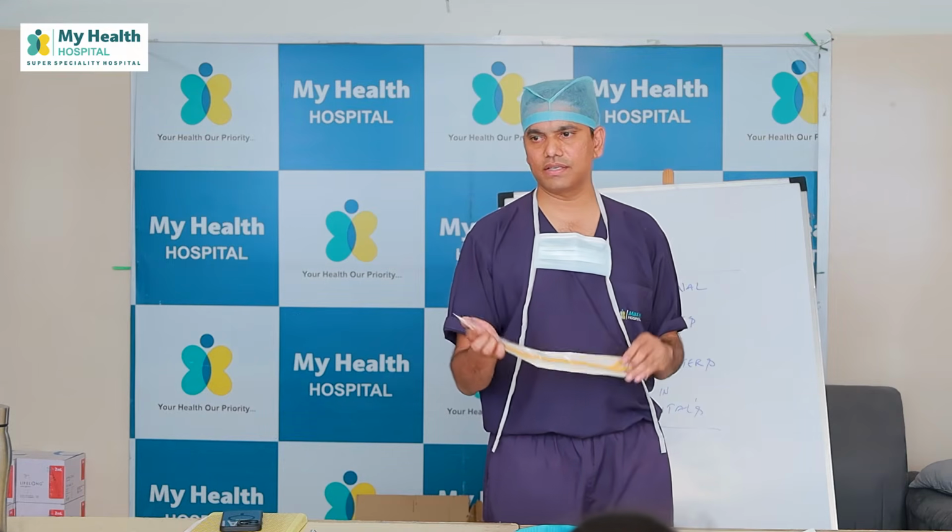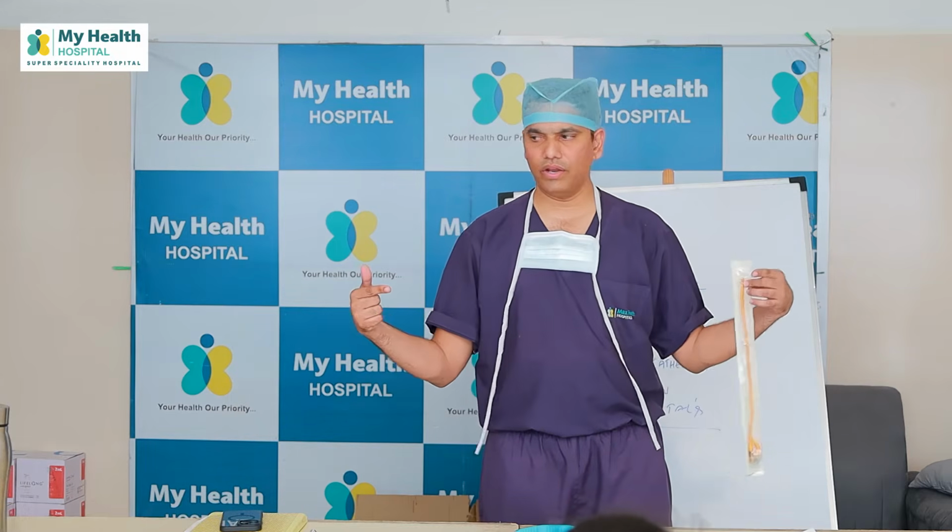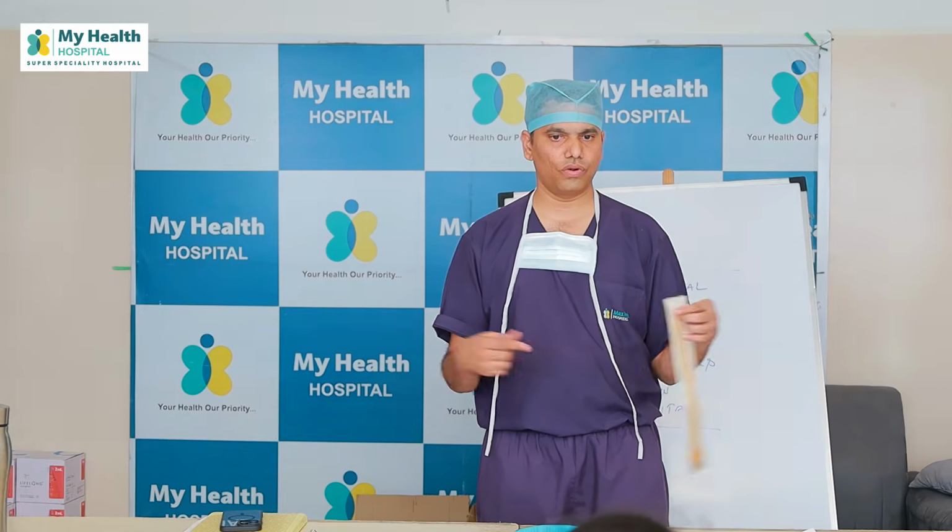Color, length, size varies again. It has 2 bulbs and the tip has holes. What is the difference in holes compared to a Ryle's tube? In a Ryle's tube, if one hole is at 12 o'clock, the other hole is at 3, the other at 6, the other at 9. Max it has 3 holes, but this has 3 o'clock and 6 o'clock.